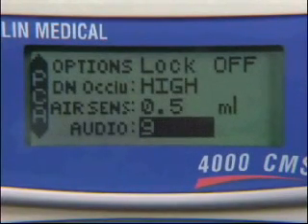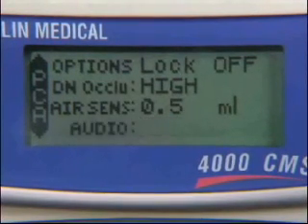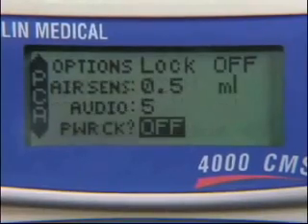The audio line displays the volume level between 1 and 9. To change it, press the No Change button and enter a number between 1 and 9 using the numeric keypad. The pump will beep once. Then press Yes Enter to accept the volume level.